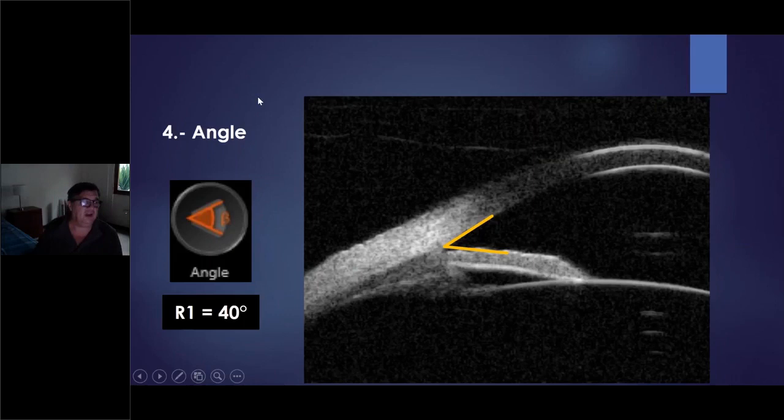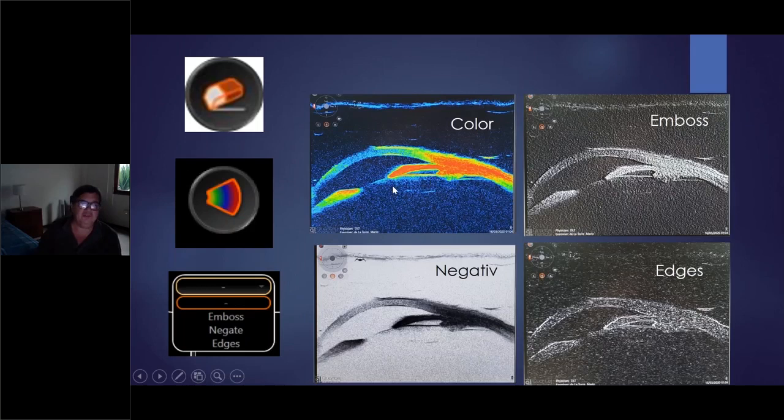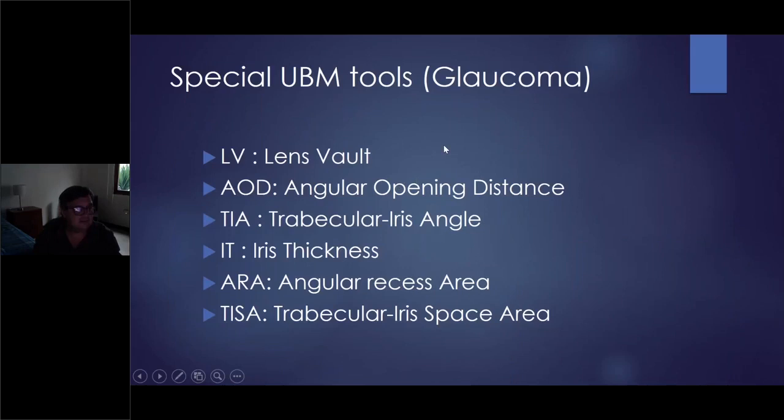And you have different filters. Color, negative, sometimes if you want to see something special, sometimes the scleral spur, you can play with your image. You can use negative emboss, for example, to see differentiations between the sclera and ciliary body, and also the iris, or the edges of the images, sometimes to make investigation. You don't use it in a normal examination, but if you need to make some difference, you can do it without any problem. The second part is the tools for glaucoma.